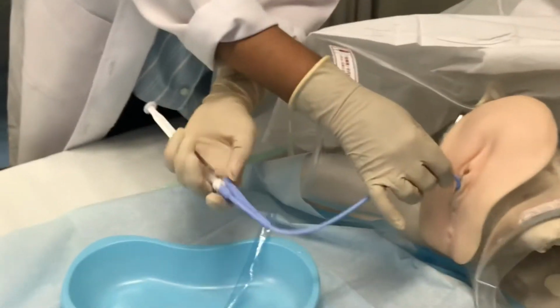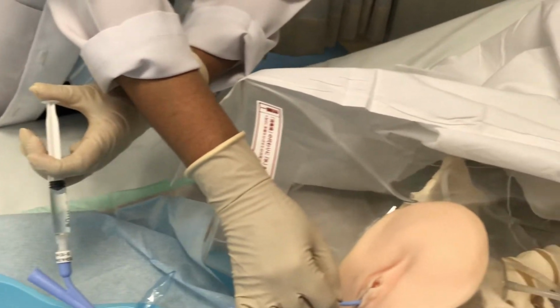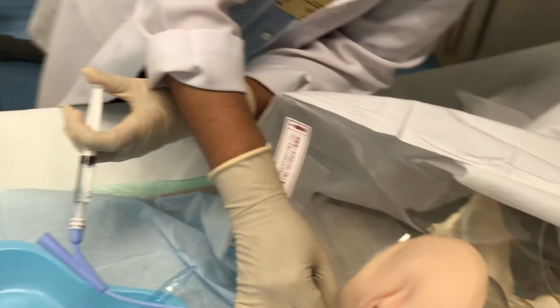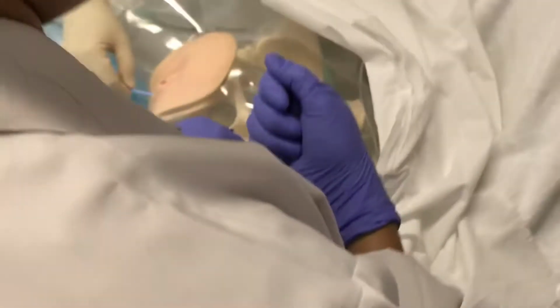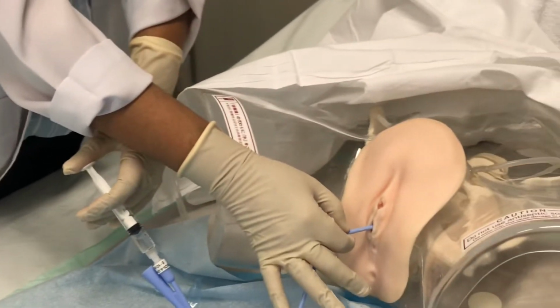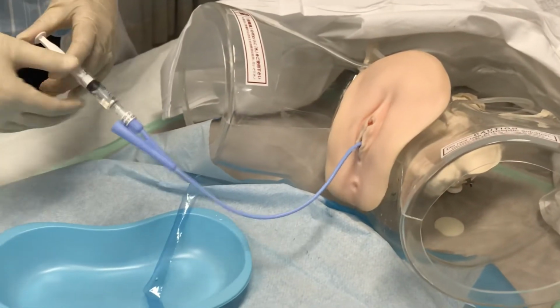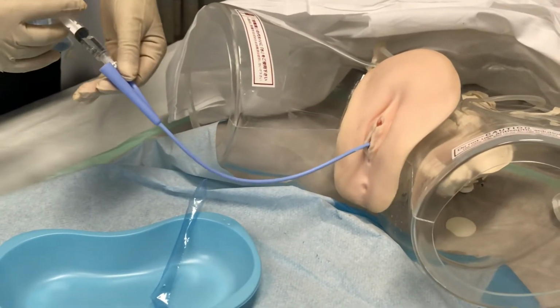Even the balloon they can see. When she is pushing also, we can see the balloon. And the purpose is so that it will not come outside, and when they are removing, they should remember to remove the water and then remove the catheter. Yes, it is inflated now. I can just slightly push it and pull it from this side. It's not coming. You can try. Little more push inside.